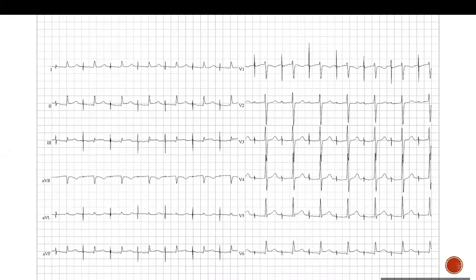Okay. So describe the QRS for me a bit. It's a narrow QRS, doctor. Not wide. Okay. And where is this QRS coming from? It's ventricular. So when you say narrow, a narrow QRS doesn't arise from the ventricle. It either is conducted through the AV node or it's coming from the AV node. So it's either junctional or conducted, right? But it has to pass through the AV node, because it's a narrow complex. So do you think it's junctional?